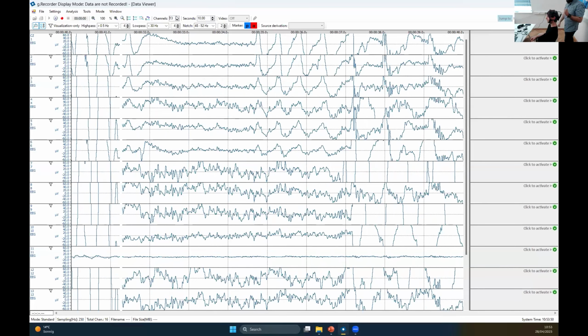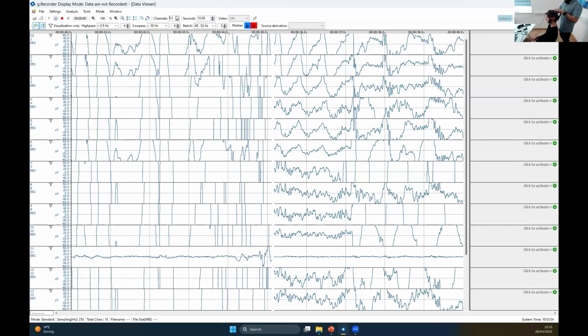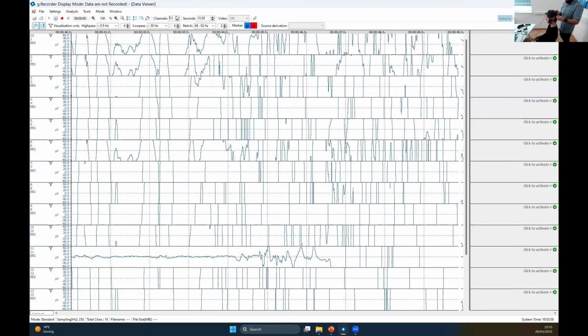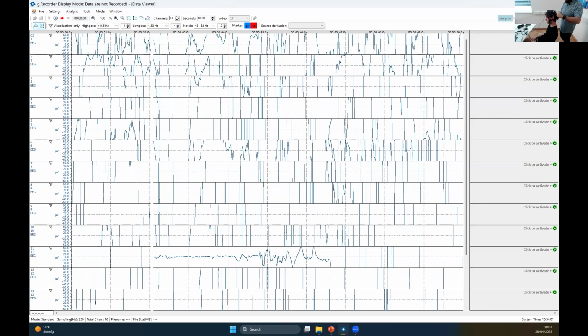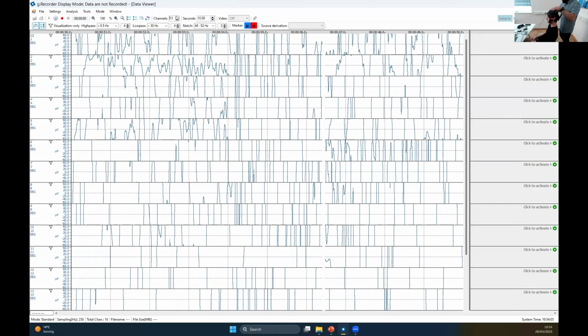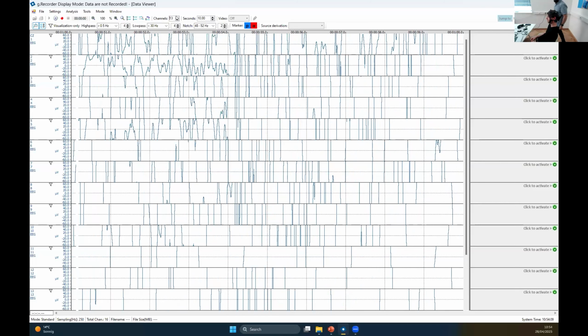And let me just, there is just one electrode, number 11. So to have a very good connection to the skin, you will need to twirl a bit the electrodes so that they really reach the scalp, right? So that the hair just goes through the pins and then really reaches the skin.